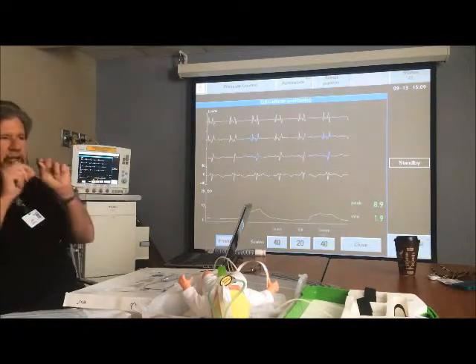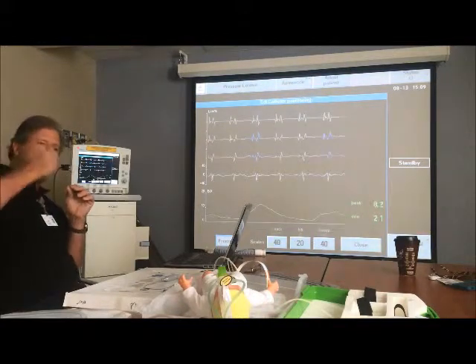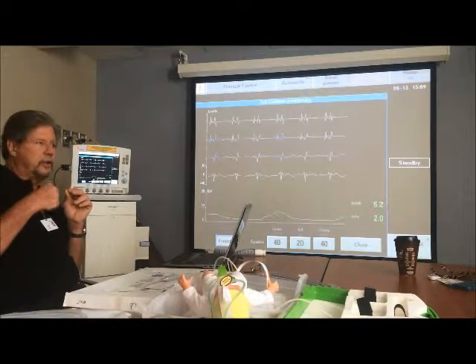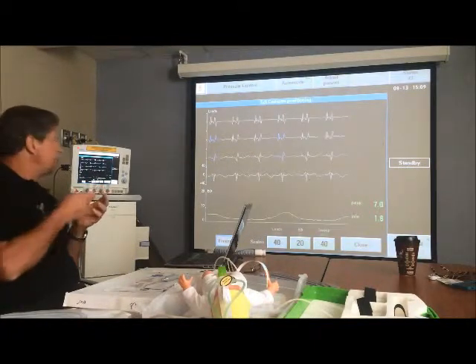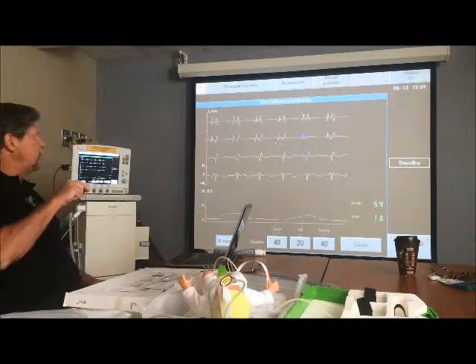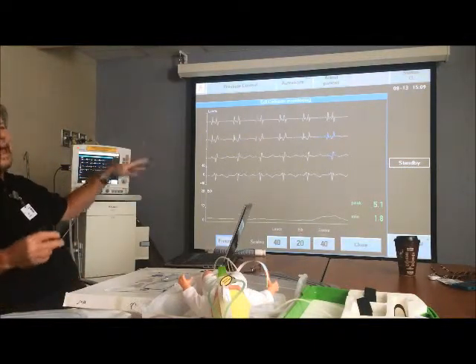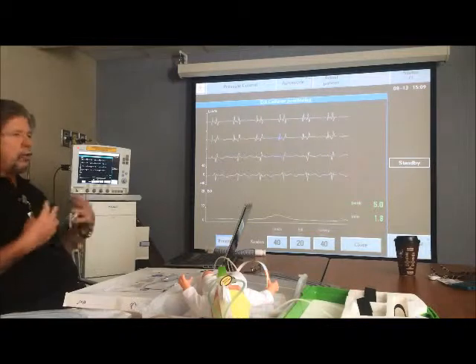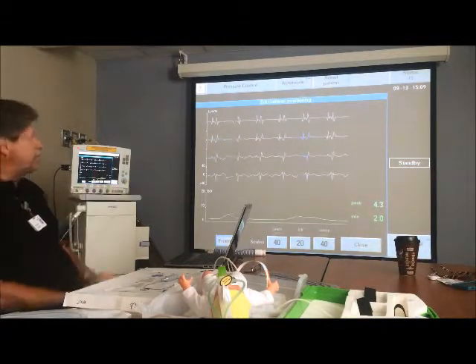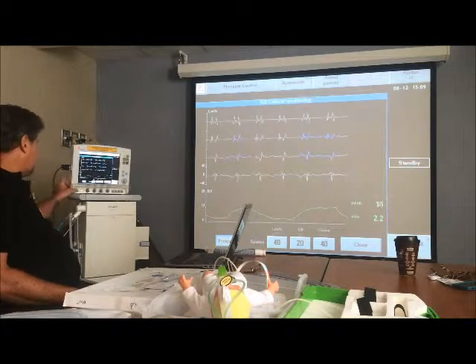Because even with the formula being measured perfectly and done perfectly, I find that for the most part the catheter isn't in far enough, and you always have to advance it a little bit more than your predicted mark. So we end up pushing it down a little bit, and you'll see the blue move from the bottom two to the top two, or the middle two. So once we do that, now we're ready to do NAVA, or we're ready to make some judgment as to synchrony and those issues that you saw before. So let me start the ventilator up again.